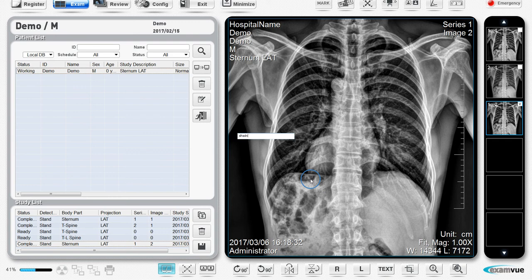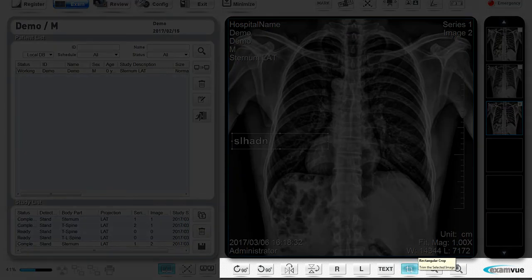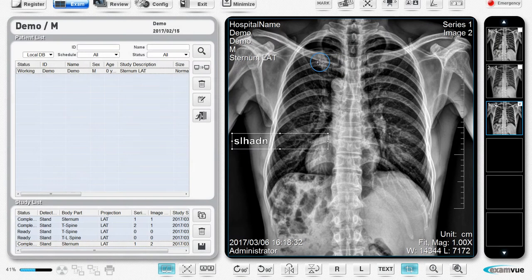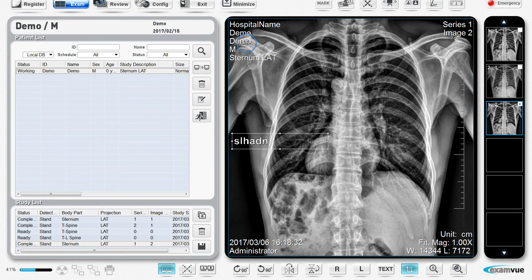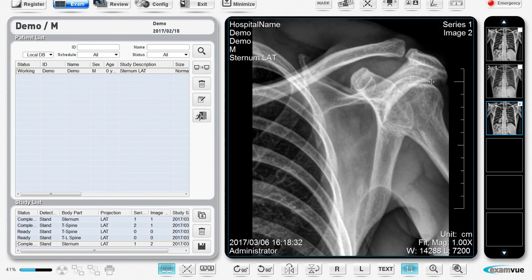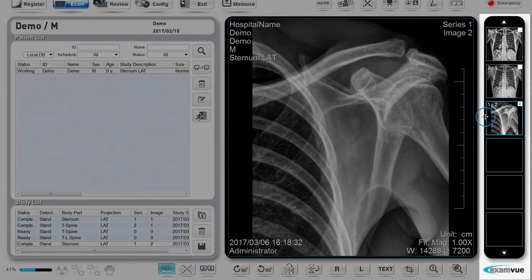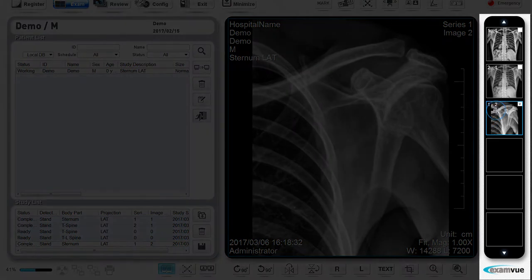To crop the image, simply select the crop button. Click and drag on the area you're interested in, then double click on the center to crop the image. If you make a mistake on cropping or any other changes you made to the image, you can undo all the changes by right-clicking on the image and select image reset.